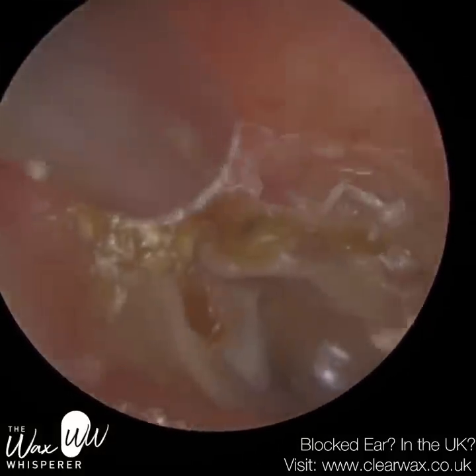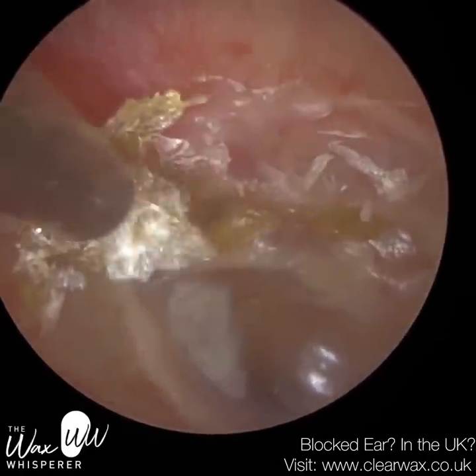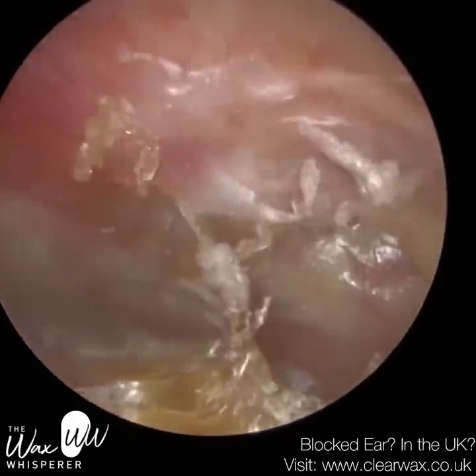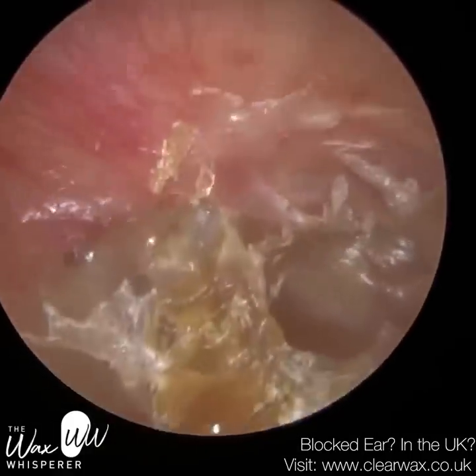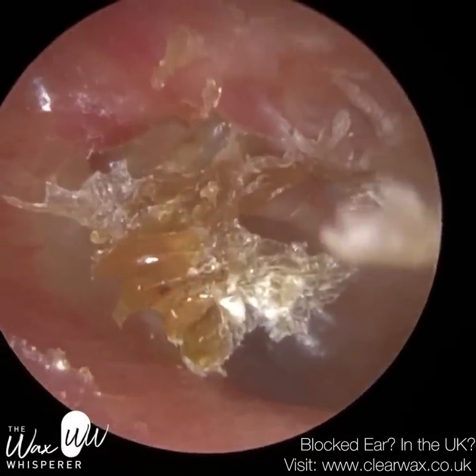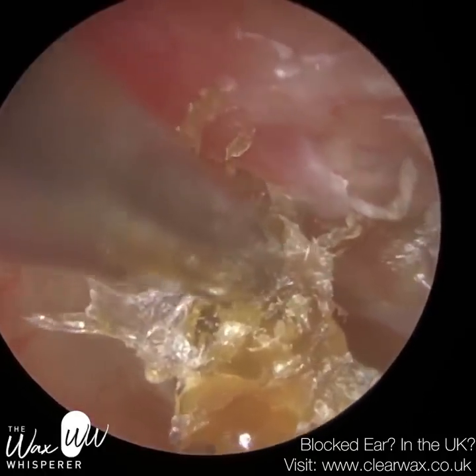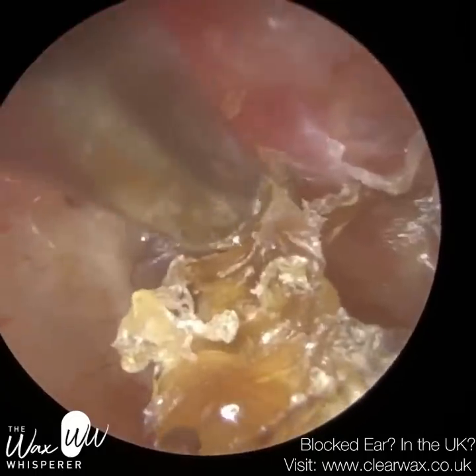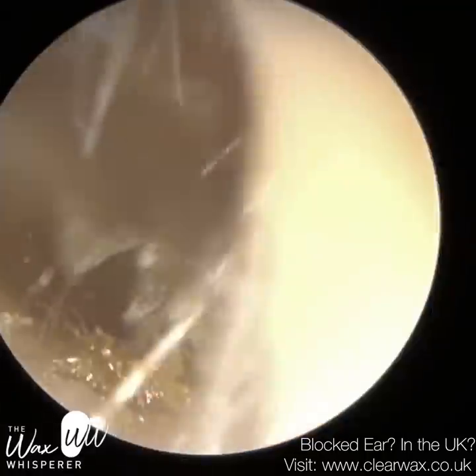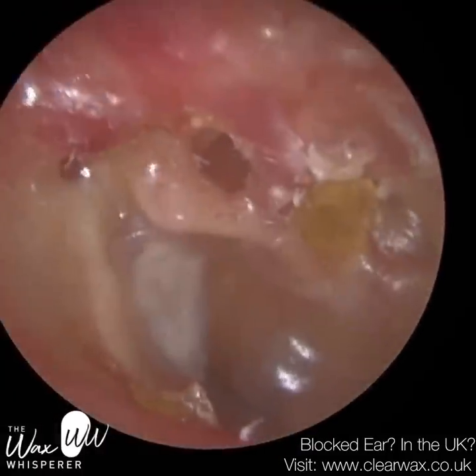This patient has already mentioned to me that they've had previous surgery in their right ear. So I'm just delicately peeling away the skin, and we're going to find a really large retraction pocket here. Fortunately, this is not yet, I don't think, developed into a cholesteatoma. Although it's growing inwards and it's stuck into the pocket — you can probably see that retraction and the bony ridge around 12 o'clock — the eardrum is still intact.